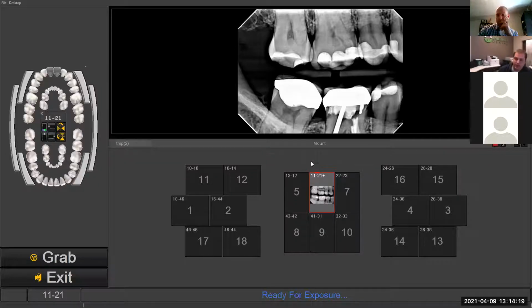I did have one other question on the sensor setups, because I know you're talking about how you can use different sensors for different companies, and that's fantastic. What about if I have 2 sensors from the same company, but I have one operatory. I've got an X-ray head, and the sensor's connected to the head on one side on the pass-through, and on the other side I've got the same thing with the same type of sensor. They're on different sides. They're routed through the network differently. Currently, I'm only able to use one of them. I can't switch between them on the fly because it screws up the software. But it sounds like this software would be smart enough that we could basically have one button for one sensor and one button for the other, and it would know which one to grab it from.